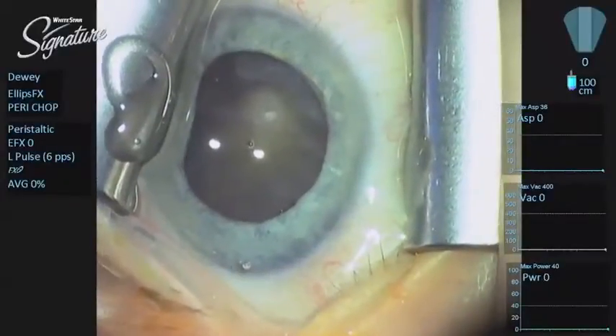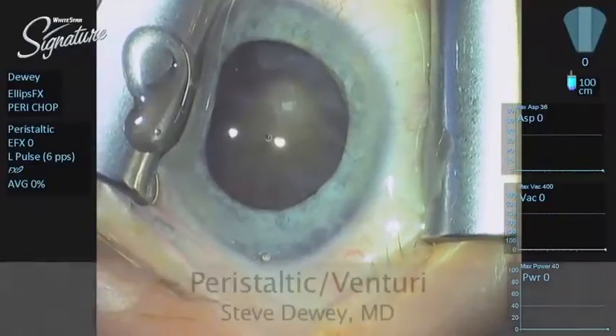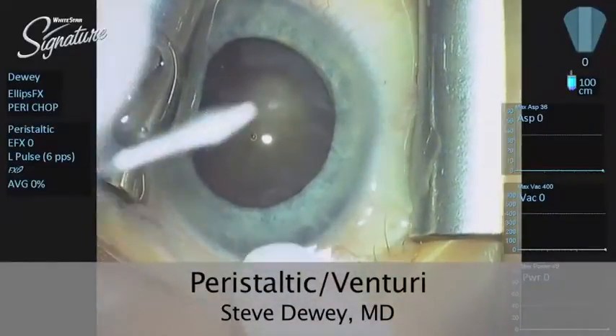You can tell this is an average extra dense cataract with a posterior subcapsular aspect to it. I love the Signature system.